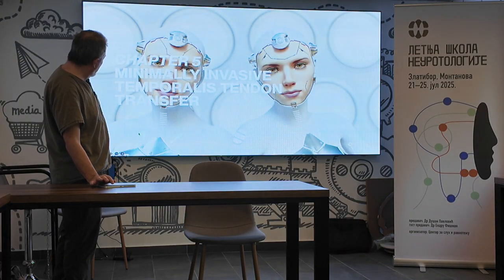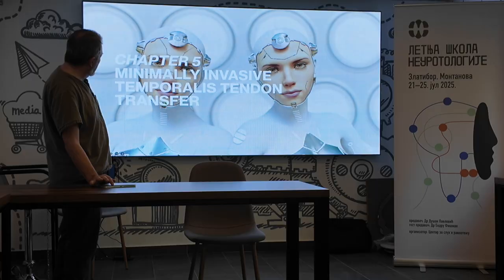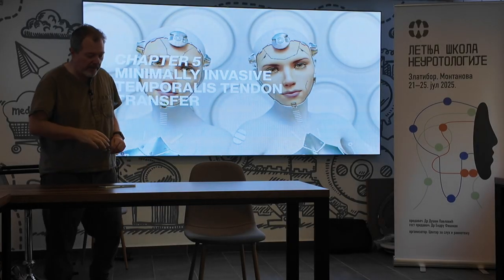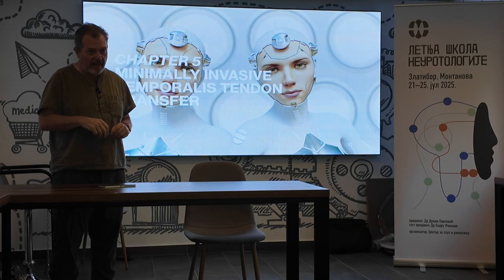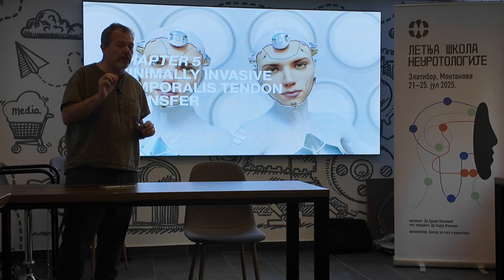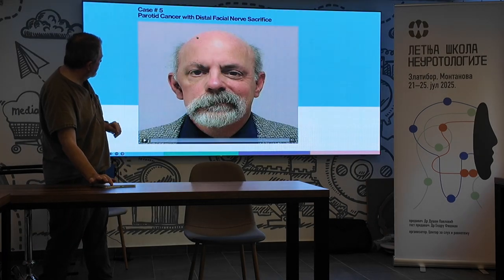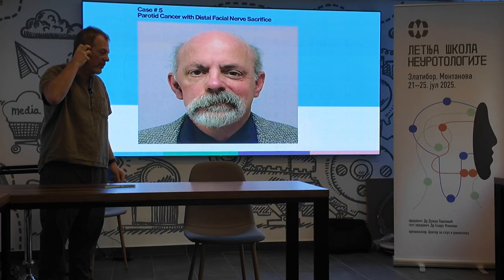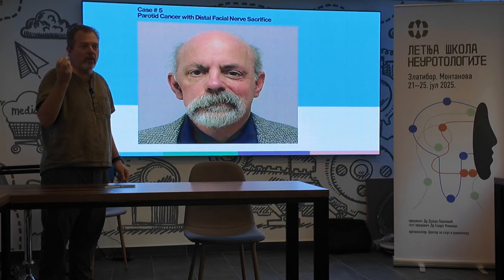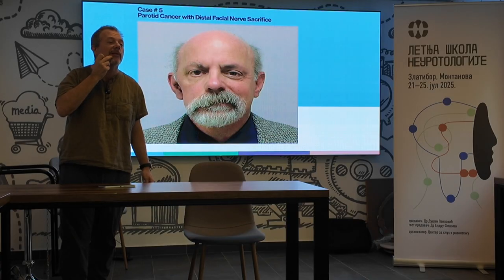So there's another operation that back in 2010, myself and one of my partners in Chicago came up with: a minimally invasive technique for reanimating the face, and I'll show you that. But first, I'll show you the operation that it's based upon. This is a patient that had a recurrent carcinoma, and this was his 3rd operation. I took his temporal bone and his whole parotid out with the facial nerve. He only had a piece of the marginal mandibular nerve left.